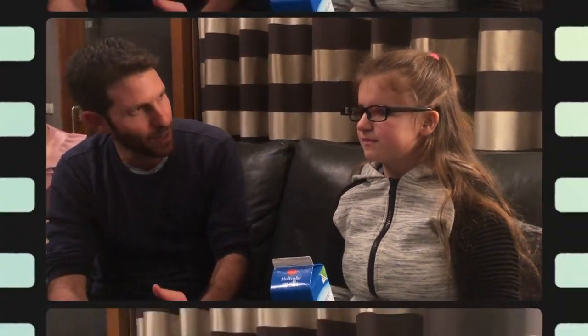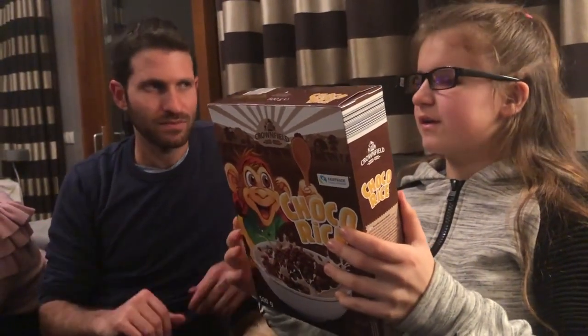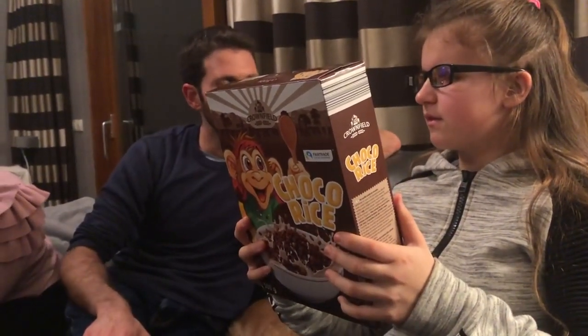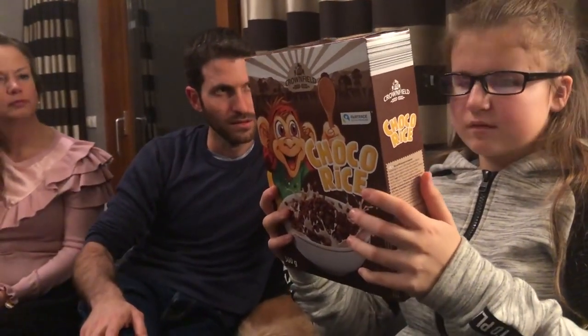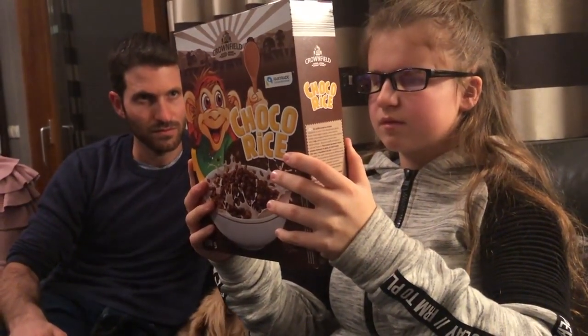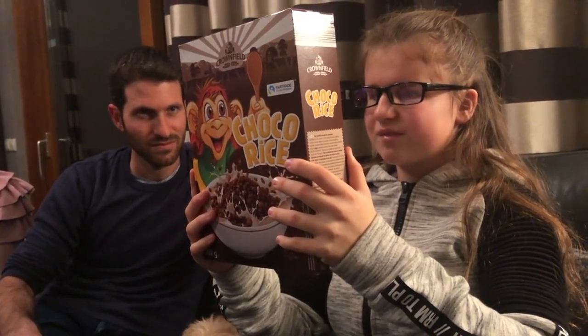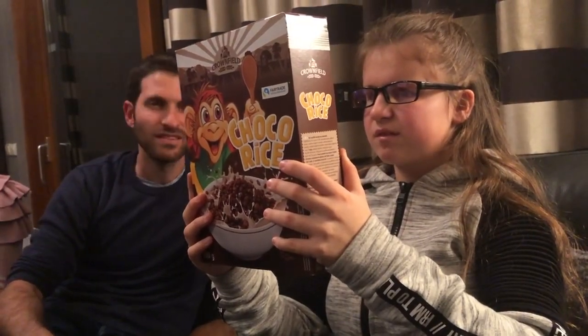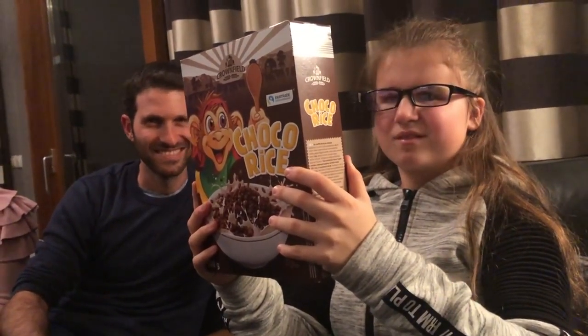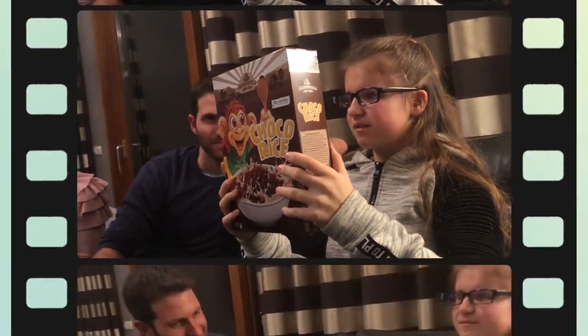Now you know it's milk — 'melk' in Dutch is milk. We also have a lot of products you can identify by barcode. First try activation through touch pointing and reading, and now try activation with the sidebar bar. Look at the product and touch it. It read the ingredients list — but it's in German and other languages too. It tried to read Spanish — that was very funny.